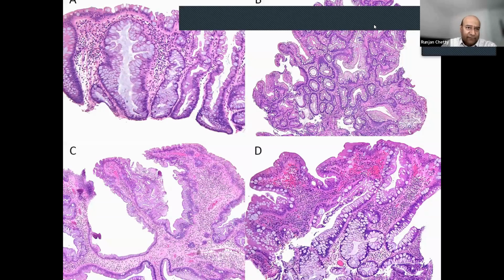This is what it looks like. Again, from an architectural point of view, you'll see this horizontal fanning and boot-shaped glands and serrations going all the way to the bottom, and dilatation. And here it looks very much like an adenoma, except that we know the background has a bit of inflammation, and I know the patient has the history. Again, you've got this sort of serrated appearance, dilated base crypt there, background IBD.